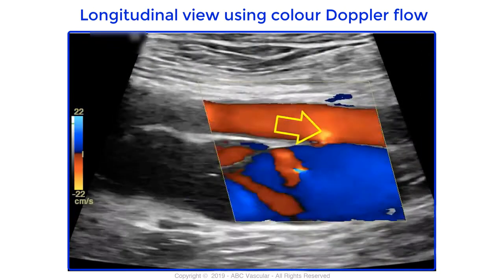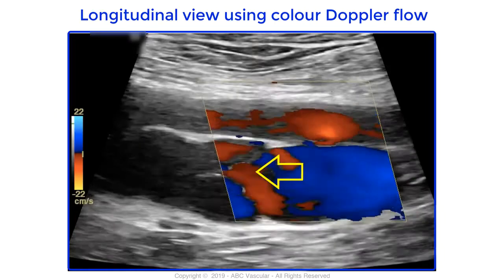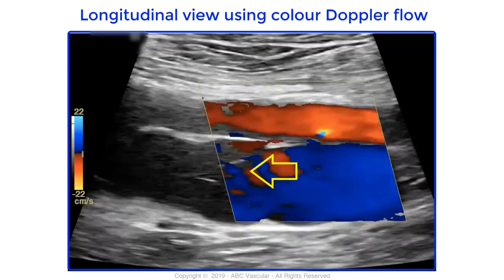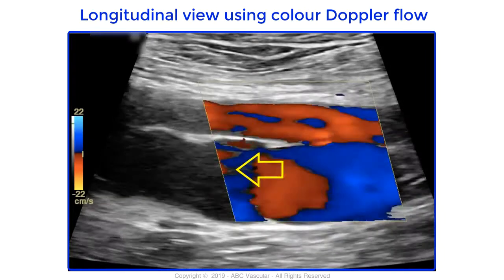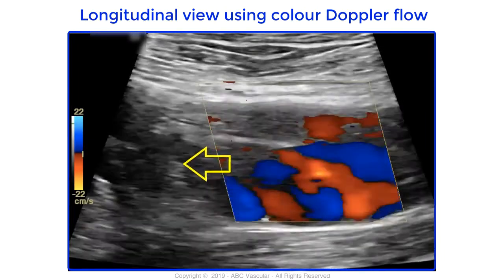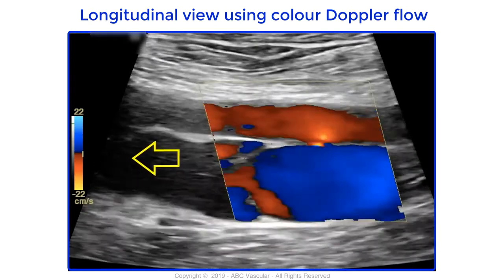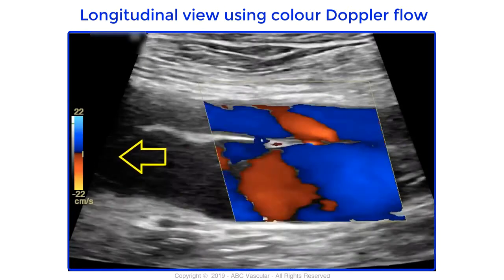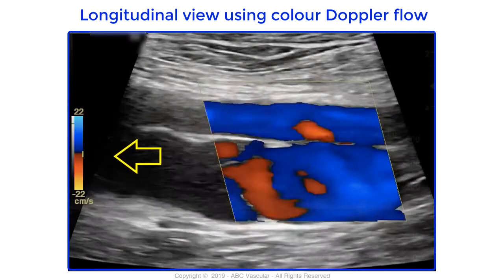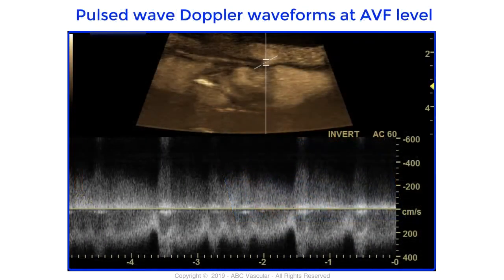Flow enters from the superficial femoral artery into the common femoral vein via the fistula, therefore increasing the speed of flow within the common femoral vein, which becomes turbulent. To confirm the presence of the arteriovenous fistula, pulse wave Doppler is recorded at the level of the fistula site.